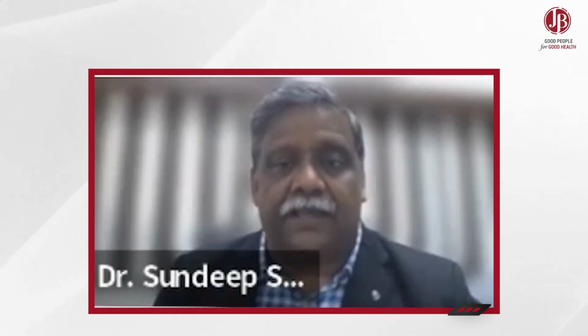Okay. Now keep these two things at the back of your mind. FEV1 is more than 70% of the FVC, and you start getting a plateau by around 2 seconds. Now I will show you what happens in a patient with obstructive airway disease. Okay. So again, the person has taken a nice deep inhalation and blows out very forcefully, but this takes a long time.